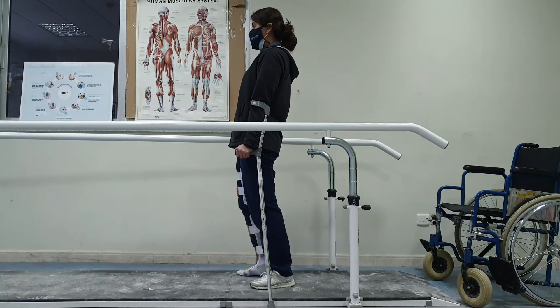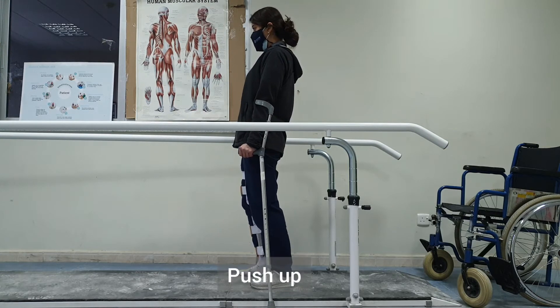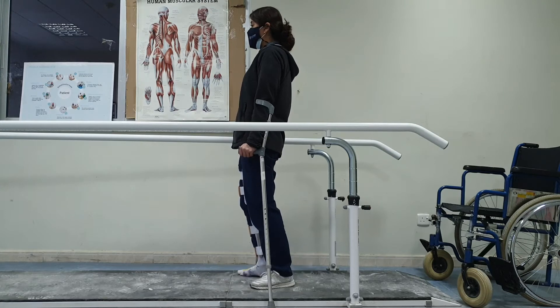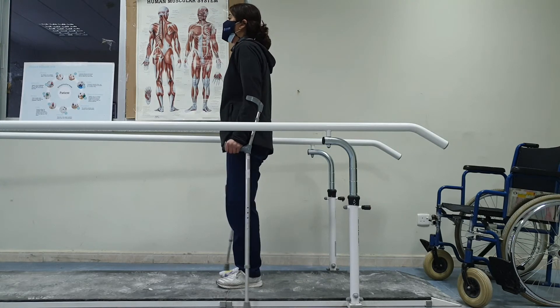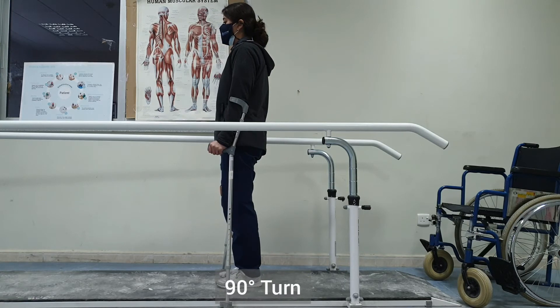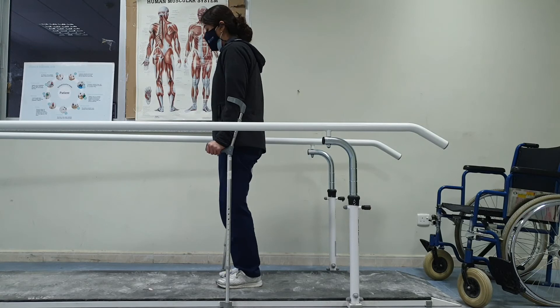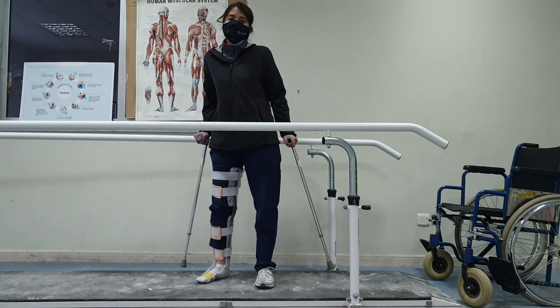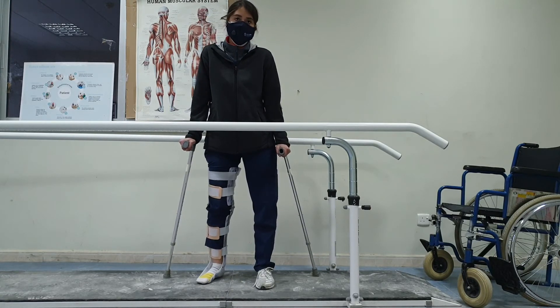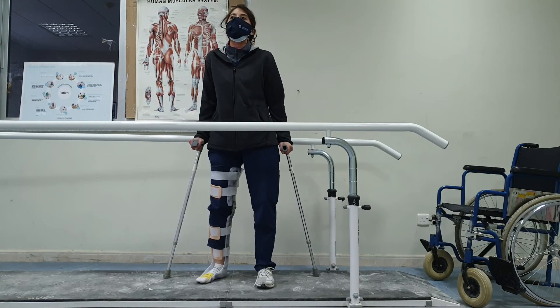Next we will do push-ups: lift your weight off the floor by leaning on the crutches. We can also add a push-up with a 90-degree body rotation — do a push-up and turn to face me. The patient can complete a full circle this way, doing another push-up and turning towards the door.